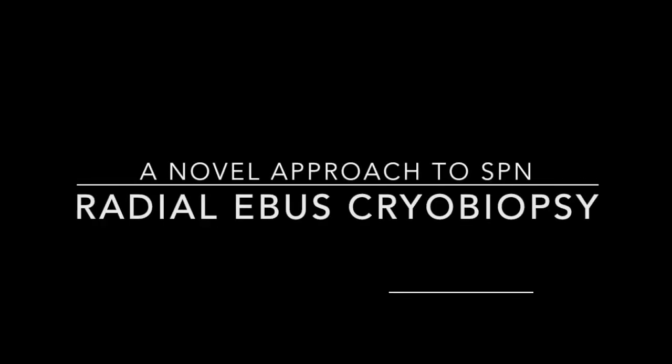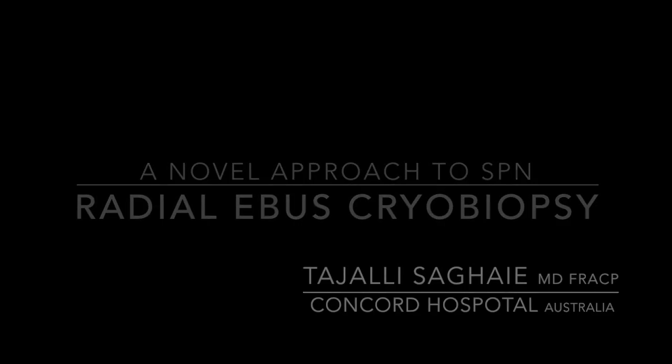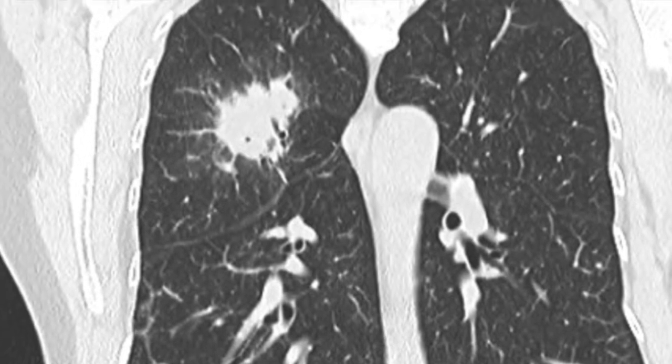In this video, we present a novel approach to the diagnosis of solitary pulmonary nodule using a combination of cryobiopsy and radial EBUS. The case of a 63-year-old female with a 3 cm spiculated parenchymal lesion is presented here as an example.